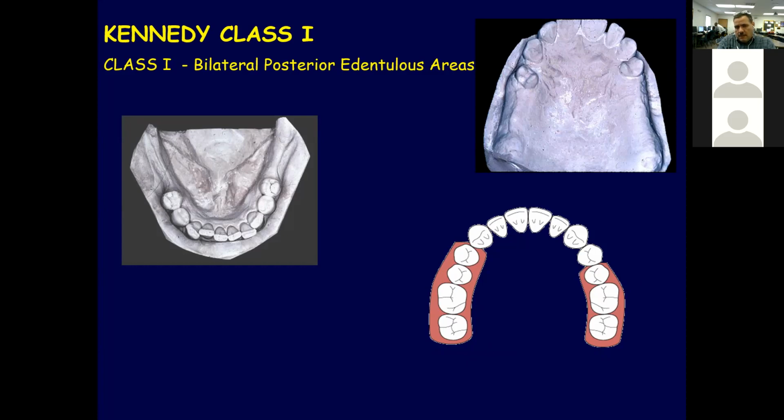Because when people lose their teeth, the area shrinks. We have less space. Can you see? And the longer the denture, the more movement you have. So usually we replace the first molar and second molar. Sometimes if we don't have space, like here, we can replace with one premolar and one molar because we don't have space. That's the thing.